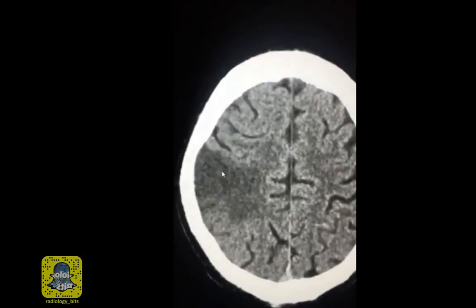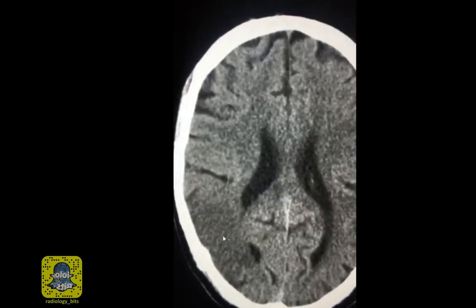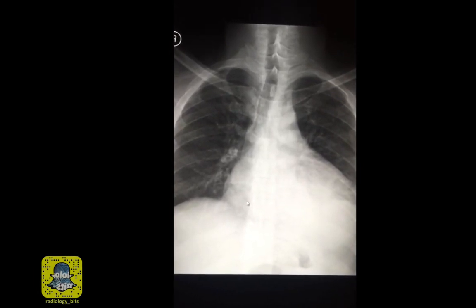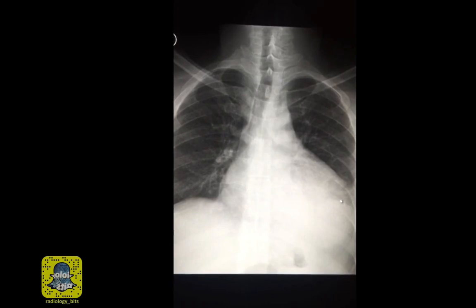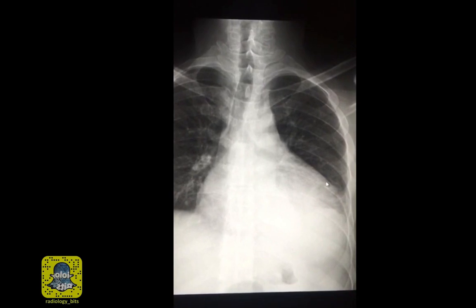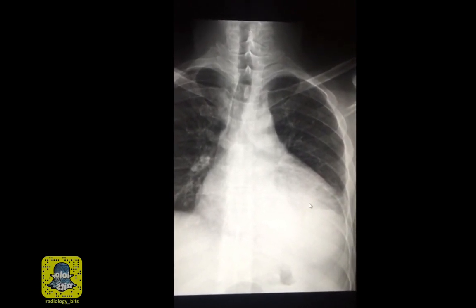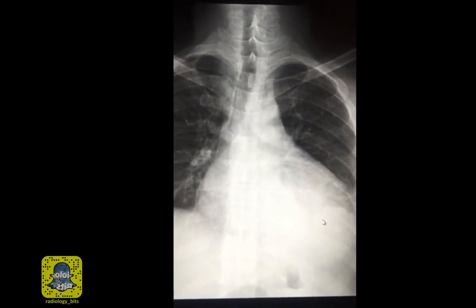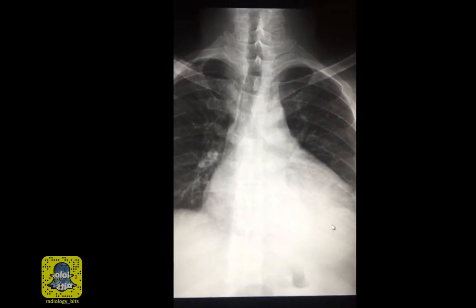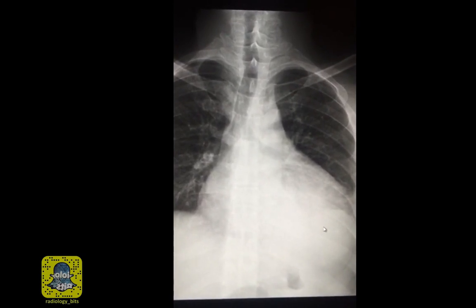So in this case, this is a patient who unfortunately had an infarction in his right frontal and right parietal lobe. And the reason this young patient who had no known risk factors before had an infarct is the presence of idiopathic cardiomyopathy. And this is his enlarged heart. The echocardiogram revealed a very poor function of the heart with an ejection fraction of 20%. They also discovered a left ventricular clot or thrombus. And this thrombus is the reason he had an embolic event that affected his brain.